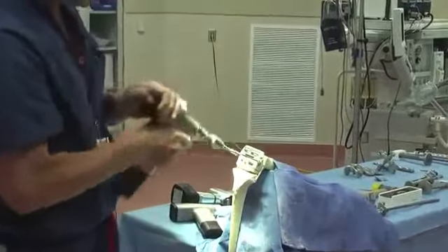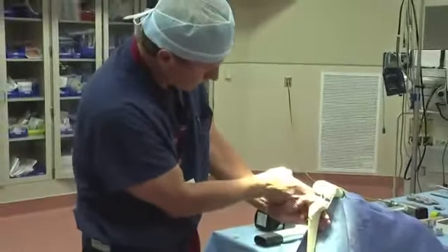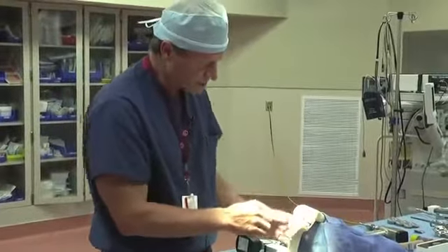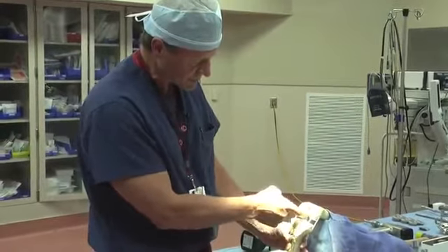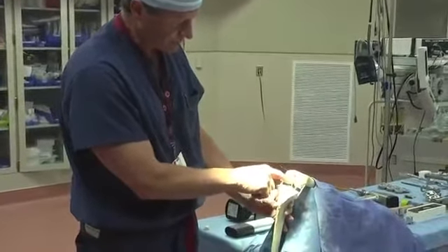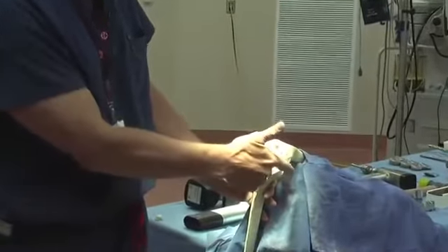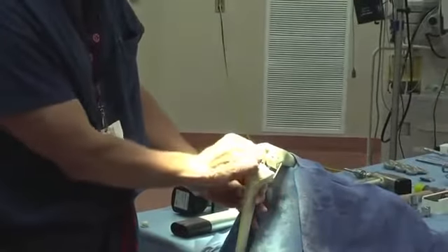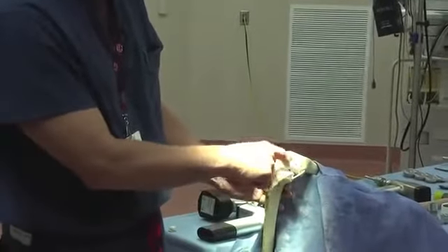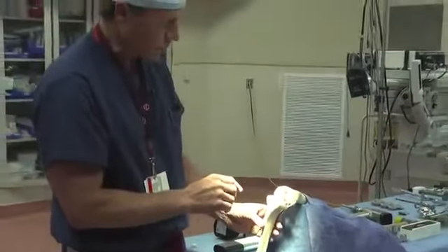Once again, the next step will be to remove the pins. After we've removed all the bone, any excessive spurs that are on here will be taken out as well. Now, this model doesn't demonstrate it, but there are some ligaments. This represents the posterior cruciate ligament, and the anterior cruciate ligament would come up in this direction here. We would go ahead, if they're still present, and take those two ligaments out with this particular implant. We would leave our collateral, or side ligaments, which are represented by these bands right here. At that point, we would also go ahead and remove any remaining meniscal or cartilage tissue. For the most part, at this point, we've got the femur prepared where we want.